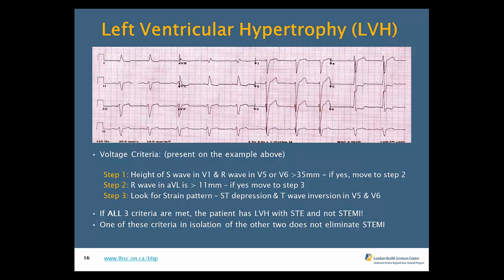I can't emphasize enough, you do a lot of ECGs out there in the pre-hospital setting. They're valuable, and I can't stress enough how valuable they are to us as emergency physicians. You're doing quite a few of them as your day goes on. Look at each and every one, and if the computer algorithm does say LVH, the way you're going to get good at interpreting LVH is saying, okay, why is this LVH? And then going back and looking at that ECG and noticing this pattern of LVH.